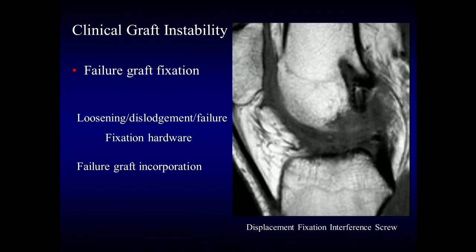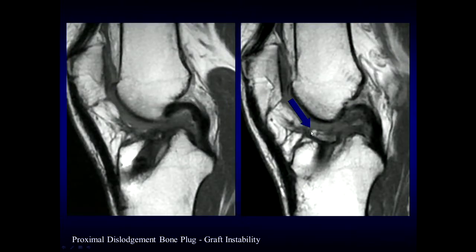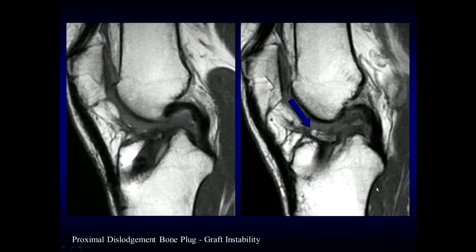Another cause of clinical graft instability is failure of graft fixation. On MR imaging we may see loosening, dislodgement, or failure of graft fixation hardware — as in this patient who had dislodgement and distal migration of an interference screw related to ACL reconstruction. We may also see failure of graft incorporation, such as failure of bone plug incorporation in a prior bone patellar tendon bone ACL reconstruction. Here a case shows a bone plug that has migrated proximally, situated at the joint line rather than fixed within the tibial tunnel, presenting with graft instability.